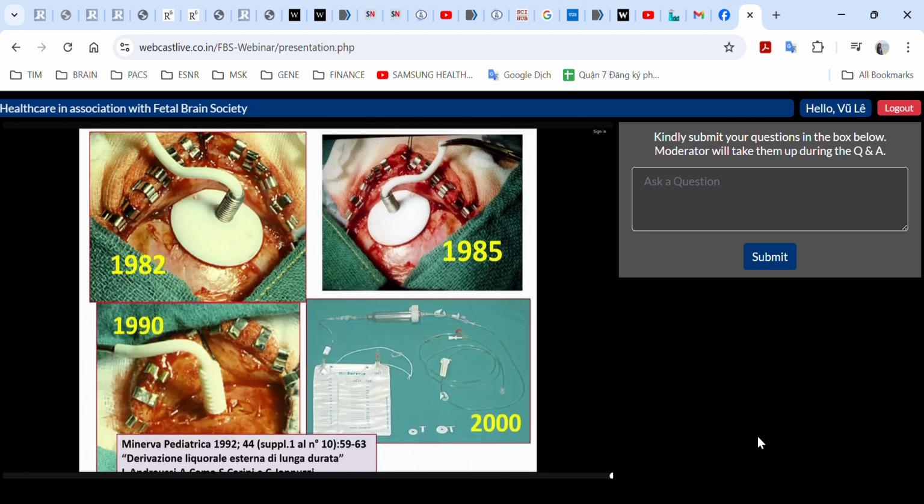The catheter is fixed to the anti-displacement device to form a mechanical bridge between the intracranial and extracranial space, preventing catheter dislocation and keeping the epidural and the extracranial space divided. Direct contact between the ventricular catheter and the skin is prevented to reduce the potential risk of infection.